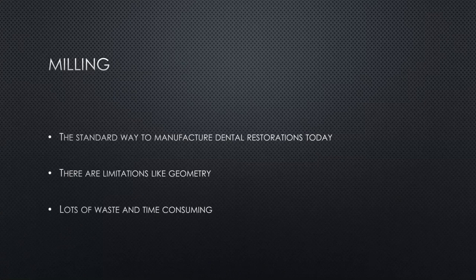With milling, you have to consider your tool geometry and factor it into your process. So there are limitations to what your designs can look like. Things like undercuts, blank height, and positioning are a few things that are drawbacks for milling.